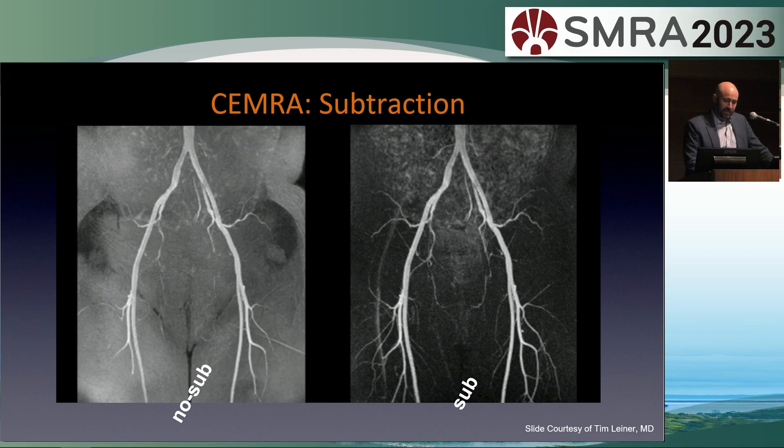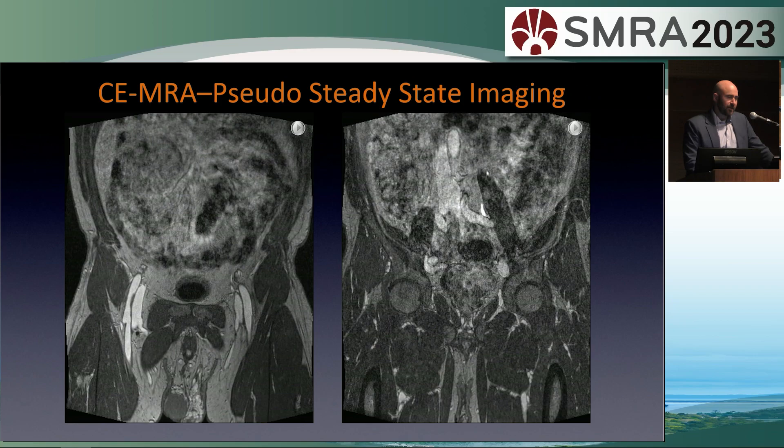A nice example of retrograde flow in the left ovarian vein going to the pelvis with pelvic varicosities. Subtraction is important from a post-processing perspective. Without subtracted images, it's harder to communicate findings with referring colleagues who don't want to look at thousands of images. The image on the left is without subtraction — contrast is only in the arteries but there's still a lot of overlapping structures. The image on the right with subtraction makes it much easier to appreciate the relevant vascular anatomy.